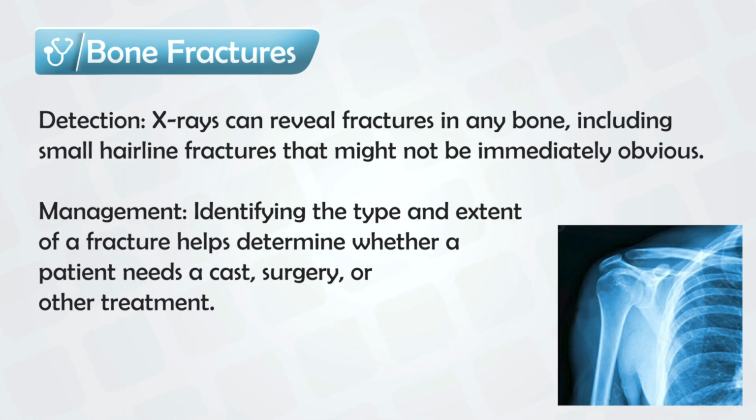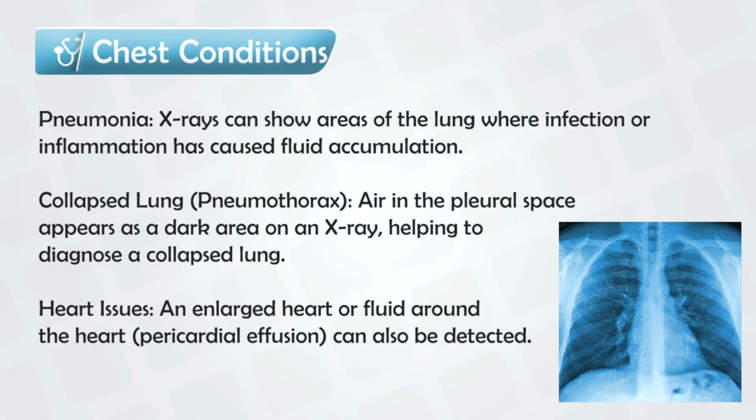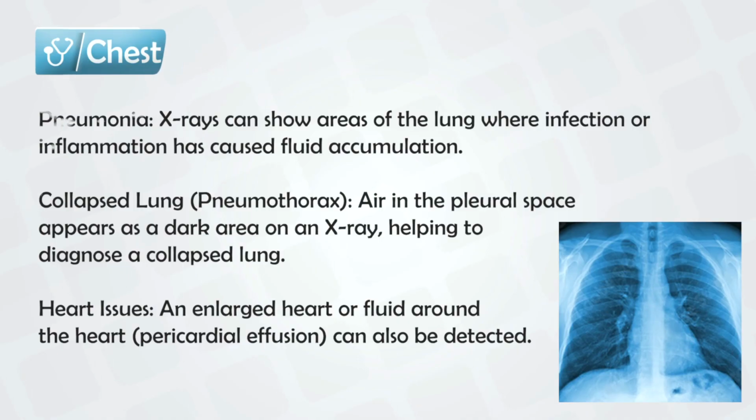If a patient presents with some serious or severe trauma and you suspect bone fractures, X-ray can be done to detect these fractures with very high sensitivity. It can also be used to detect chest or cardiac conditions like pneumothorax or pericardial effusion. Again, the sensitivity is not very high, but it can be detected.